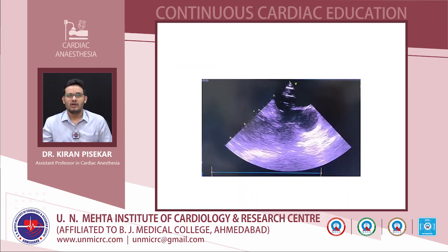Okay, so this is a slide. This was a case in which we were doing a mini ASD closure. Now there is an ASD. When the surgeon cannulates using a femoral vein, they will insert the guide wire, and the guide wire has to pass into the SVC.